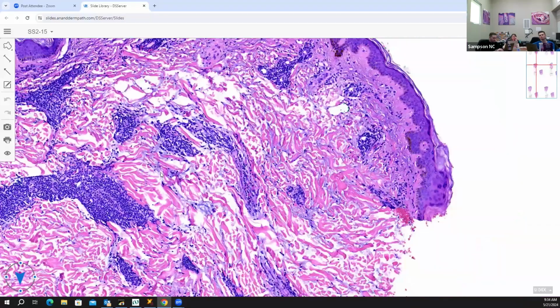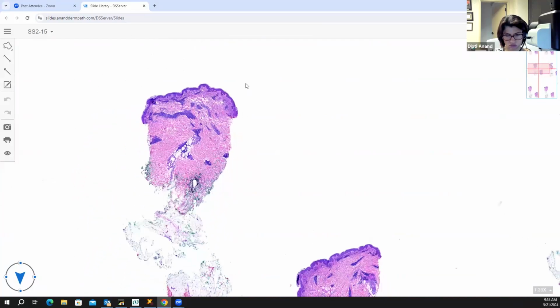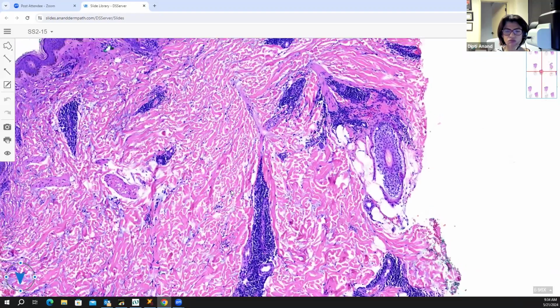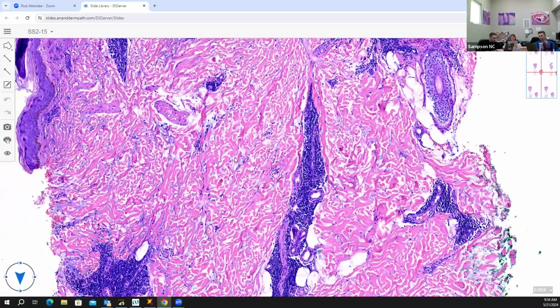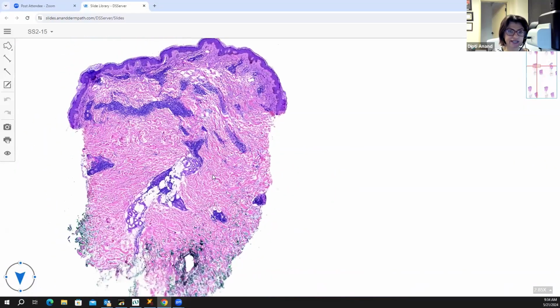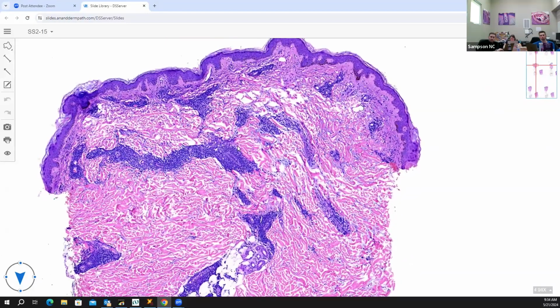When we have superficial and deep inflammation like this, we also have to consider lupus. So if you're thinking about EAC, this is a pattern of tight lymphocytic cuffing. It's a cuffed pattern, which you will see in gyrate erythema versus, like, lichen striatus.